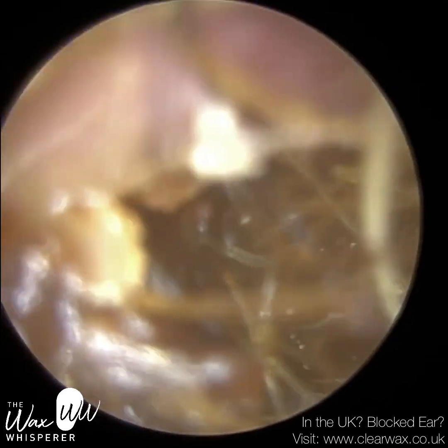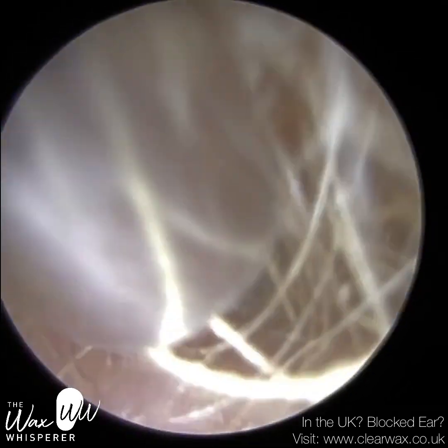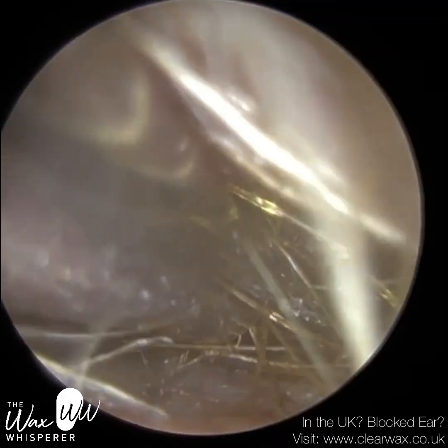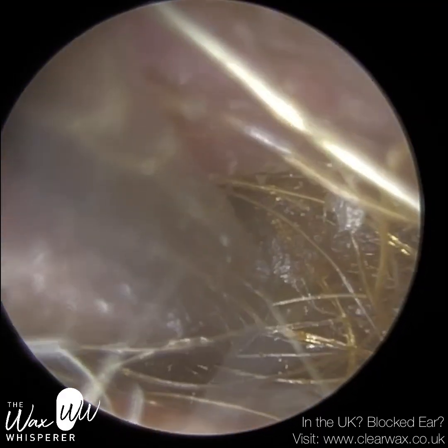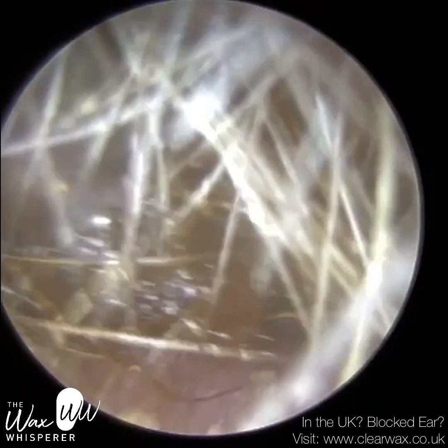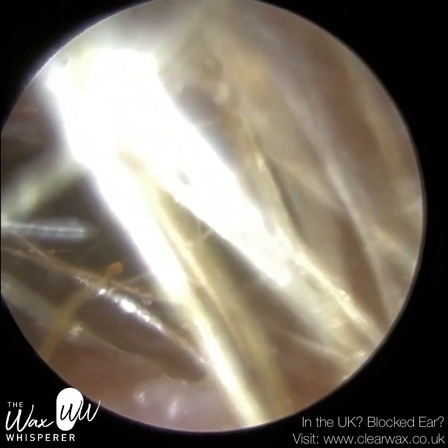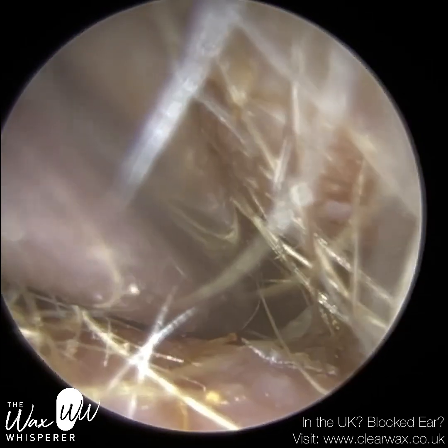So I've managed to remove some of the lateral wax near the entrance, and now you can see that swelling at the top of the ear canal, and we're just going deeper into the ear, and the suction probe only just fits in the ear canal. And as I was entering the ear with the sucker, because the ear canal's swollen around it, so when you've got swelling in the ear, you've got edema, you've got a build-up of fluid, sometimes blood, but in this case it's just fluid, and the fluid is attracted by the suction.